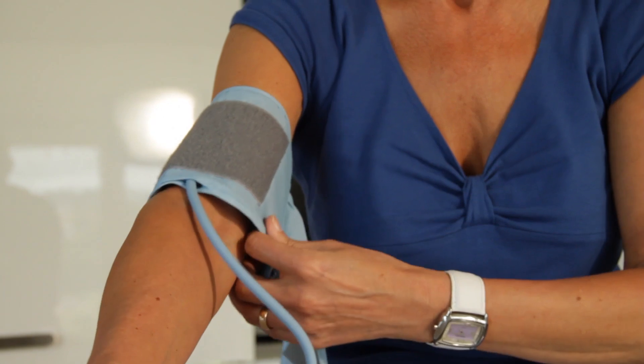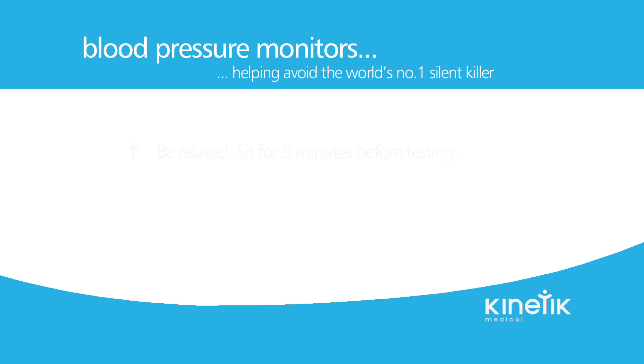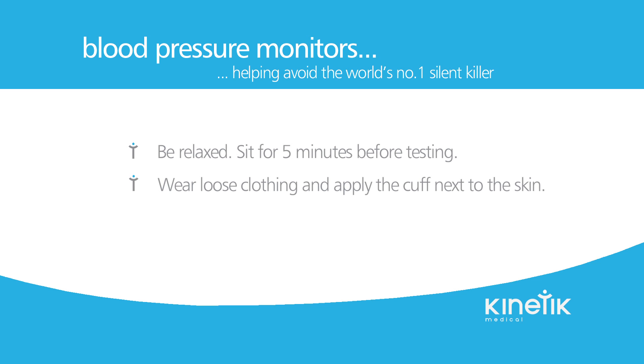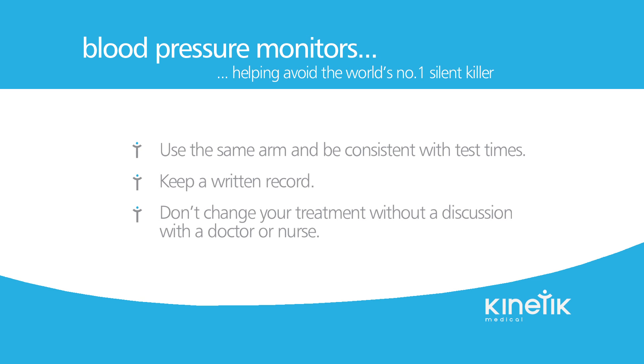Remember these key points for successful and accurate home blood pressure measurement: Be relaxed. Sit for five minutes before testing. Wear loose clothing and apply the cuff next to the skin. Keep still and don't talk. Use the same arm and be consistent with test times. Keep a written record. Don't change your treatment without a discussion with a doctor or nurse.